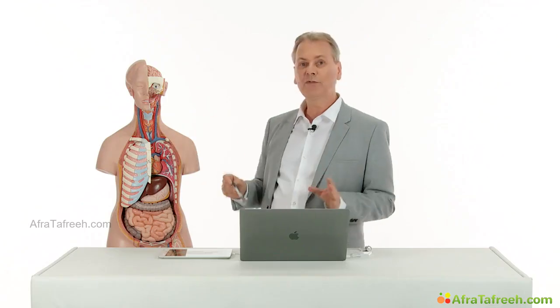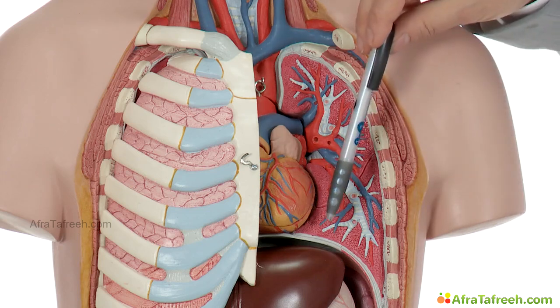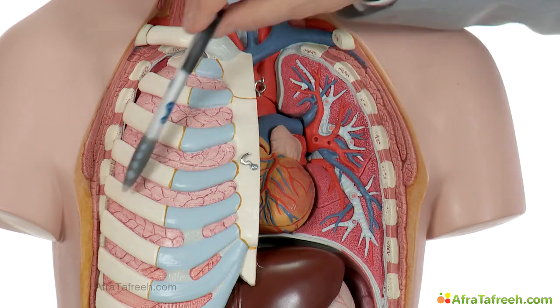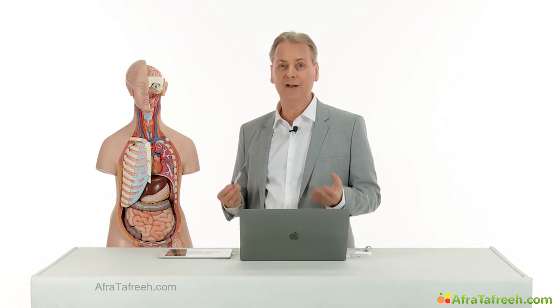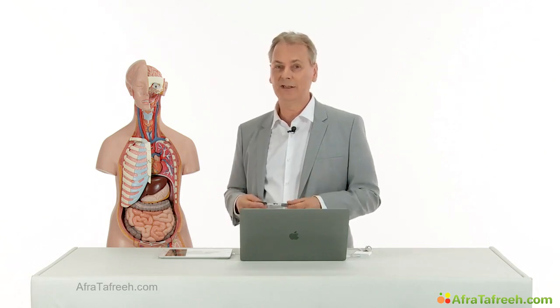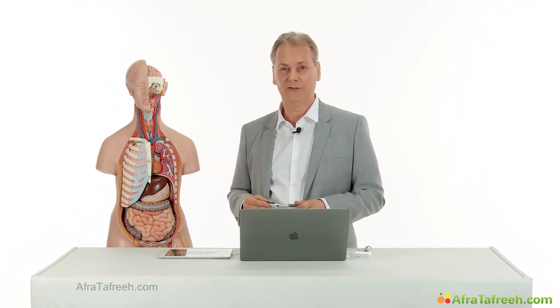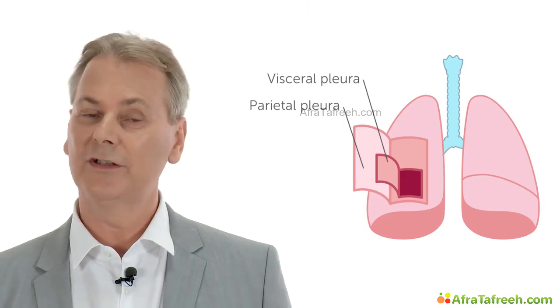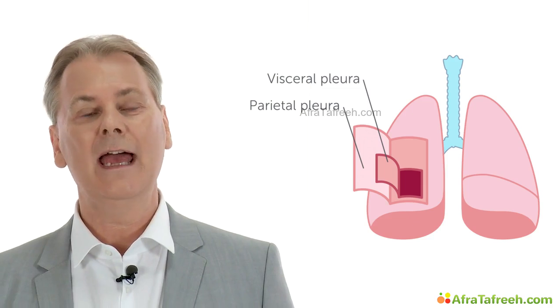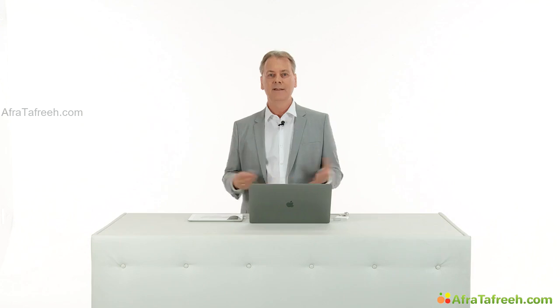This diaphragm moves during inspiration, it moves downwards. Remember, underneath the left lung, we have the spleen, and underneath the right lung, we have the liver. Observing the motion of the diaphragm during the ultrasound examination will provide a lot of information, and we will need this if you want to detect pleural effusions. The lung is covered by the pleura. We have the visceral part, which lies directly on the lung, and we have the parietal part. In between is the pleural space. This is exactly where pleural effusions accumulate.